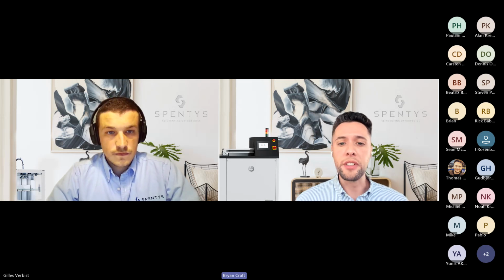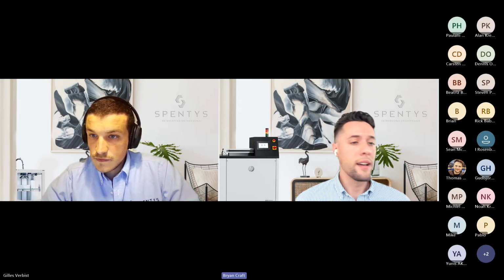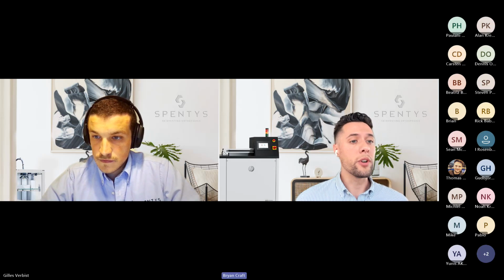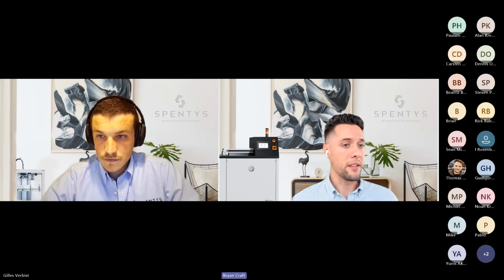I liked Alan's question about direct limb scanning. Absolutely. We believe that that's a good way to save costs as well for clinicians and technicians if you're scanning direct limb.